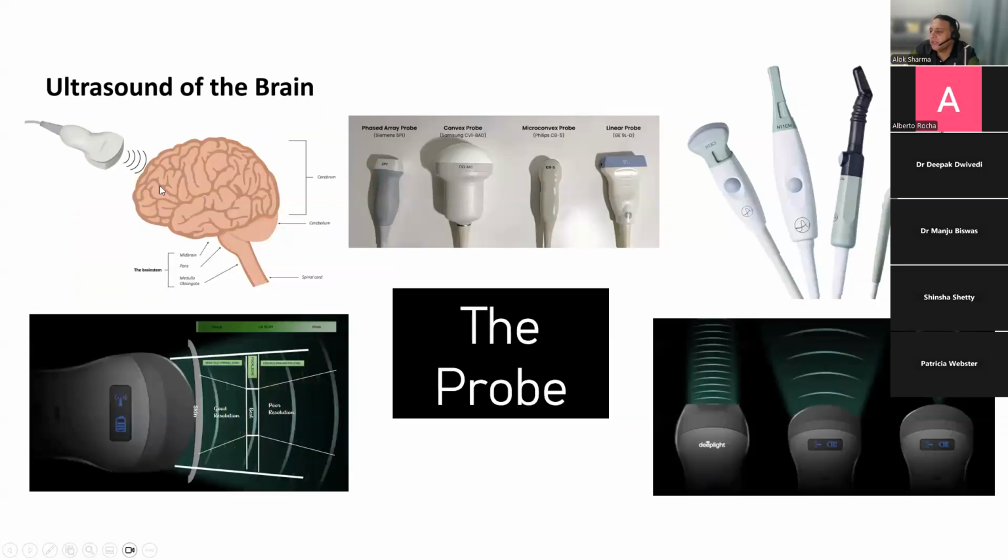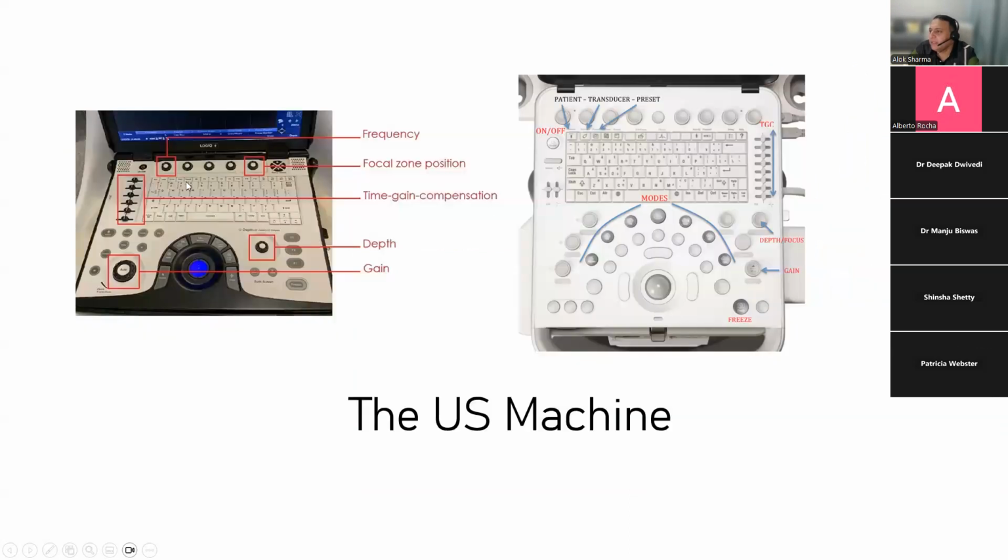These knobs that you see over here, my apologies, they basically help. As I told you, they're linear knobs. So when you're increasing them, you're increasing the brightness of the areas of the brain. These are the superficial areas of the brain. These are the deeper areas of the brain. So if I find that the deeper areas of the brain are not giving me really good images because they're quite dark, I will increase their acoustic signal return by turning the knobs to the right.